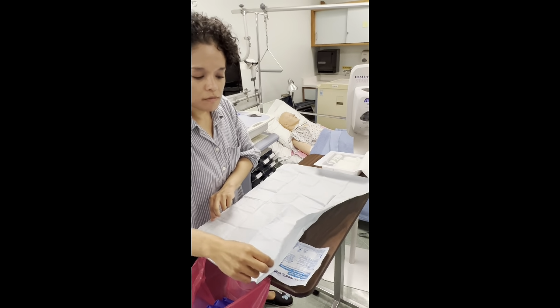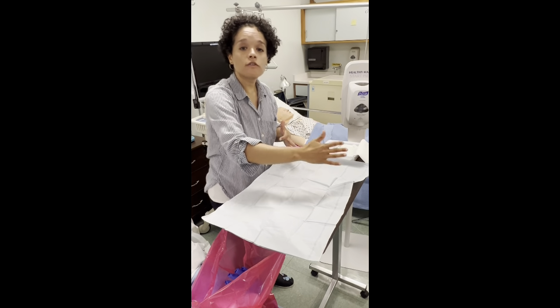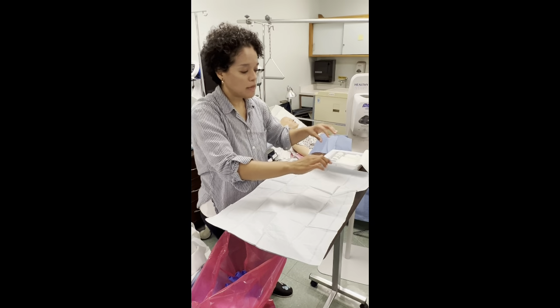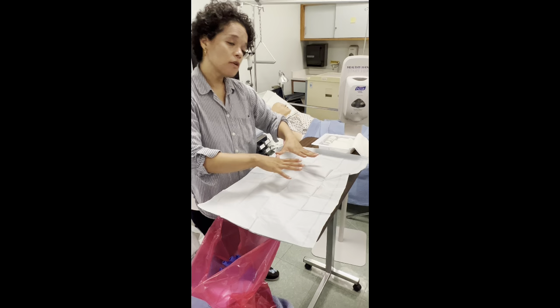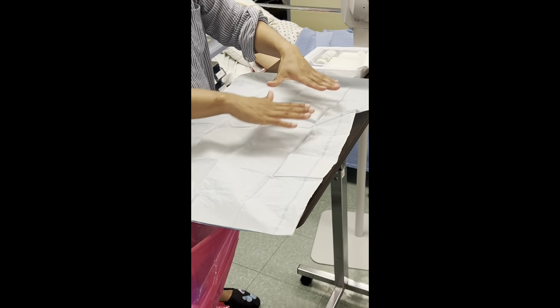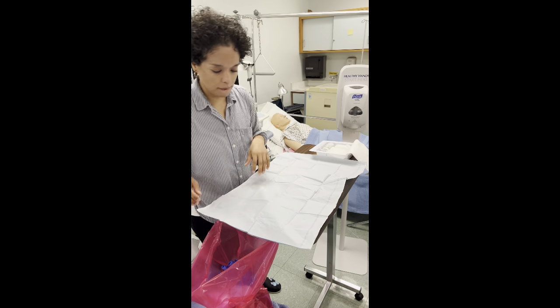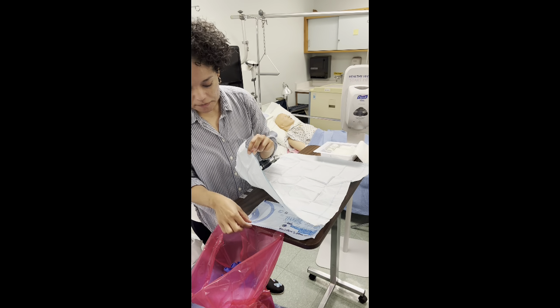Now be mindful that the sterile field has an area in which if you place any objects or even your hands would be considered contaminated. That would be the 1-inch border around the sterile field. So please, just make sure that the center is the best, and that's where it's sterile. Outside of the 1-inch border, that's contaminated. Okay, so I have the gloves over here.